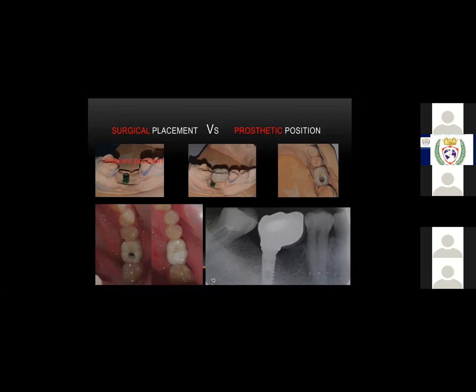When I spoke to the patient and explained all these procedures, and insurance was covering it for the patient, everything was going well. So I chose 3 implants, to be at lesser risk. But yes, 2 implants, 1 big implant in the socket and 1 more implant distally, connected with a 3-unit fixed partial denture, is definitely the other option.